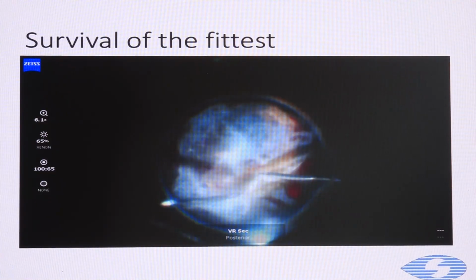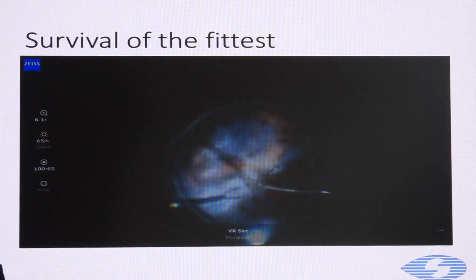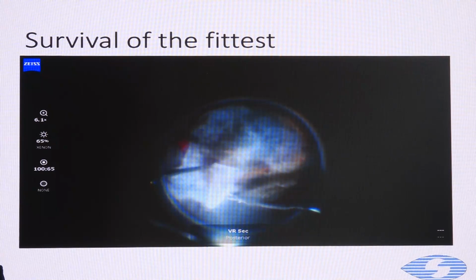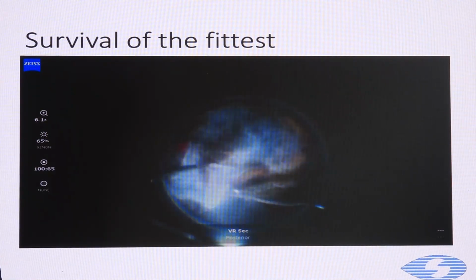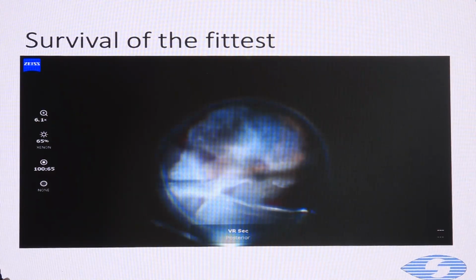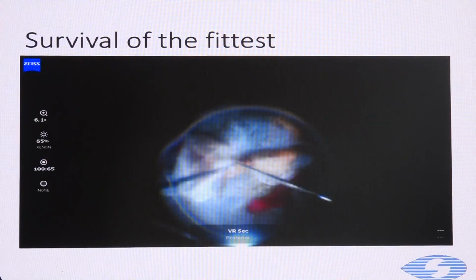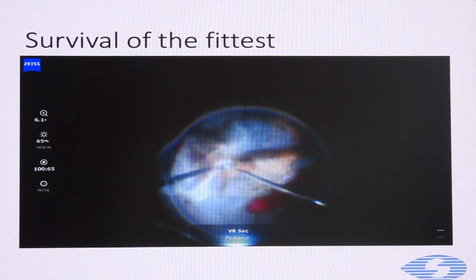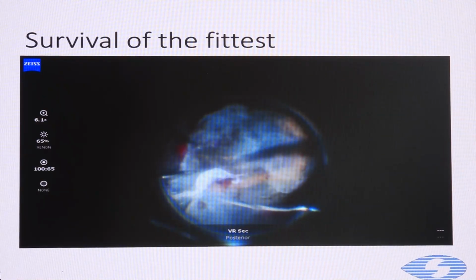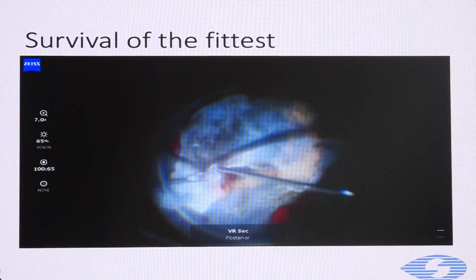Very carefully you enter, and then finding a vertical clear edge, you dissect the membrane into two halves. Again, these vascular nails are extremely tight. So what I personally feel is, if you create a plane of separation around them, hold the membrane with one hand very steadily, and then tackle each and every nail as you go along. And then again separating all the vascular connection in that area.